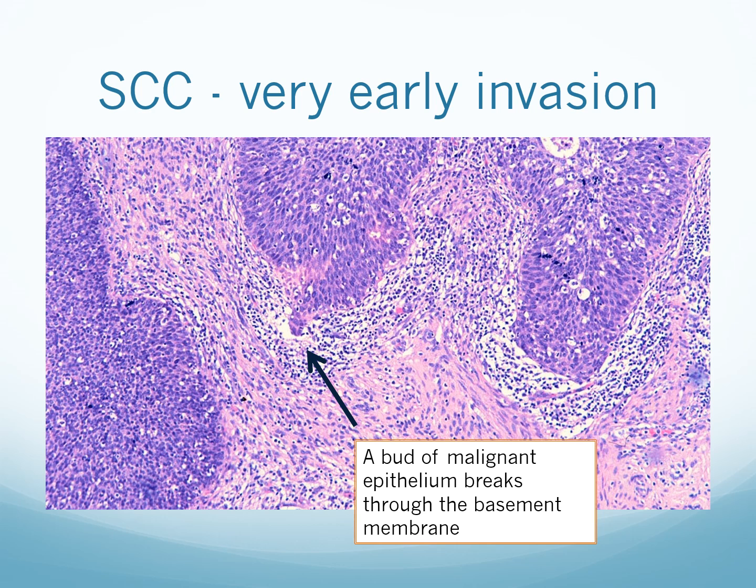Squamous cell carcinoma arises from high-grade squamous intraepithelial lesions. So here we have CIN3. It has extended down into glands like the squamous metaplasia, but in this area here it's still bounded by the basement membrane and so is not invasive.